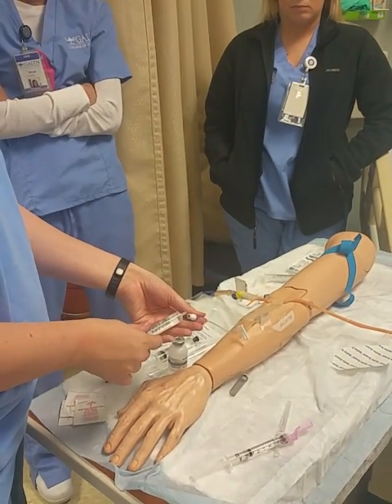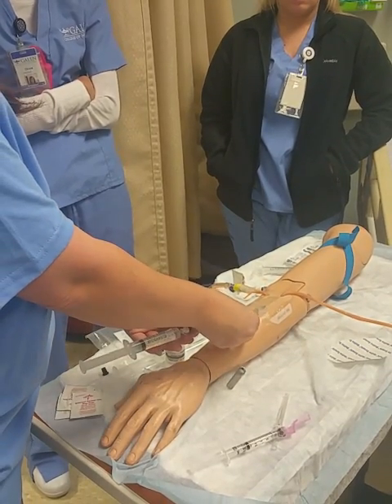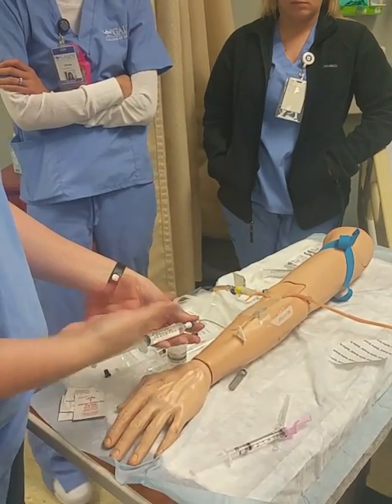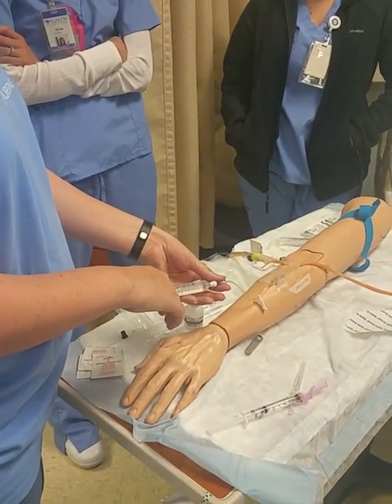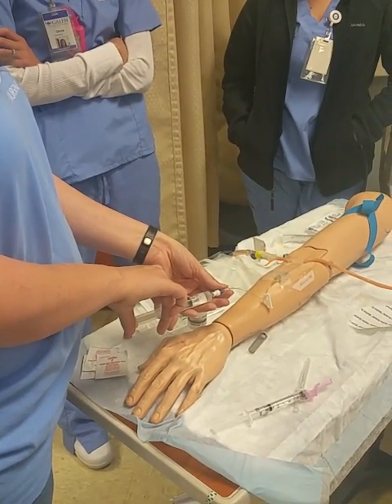With your first flush, you want to aspirate. So open your clamp and pull the plunger back. Now, I'm not in this vein, obviously, so I got air. But I would want blood in here to make sure I'm still in the vein, it still works. So I'm going to flush it. Flush is nice and easy.